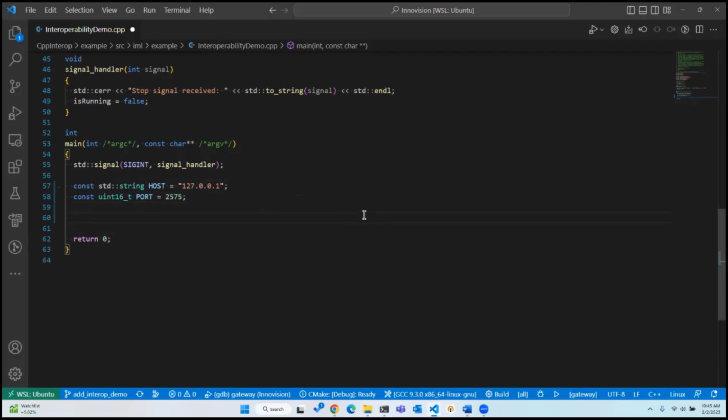Okay, so let's set up our scenario. So today, we are going to be sending data from the Acme pulse ox, and we're going to send oxygen saturation and pulse rate to the super EMR. So all the data will be sent using HL7, just for this example. And to get started, I'm going to define that data.